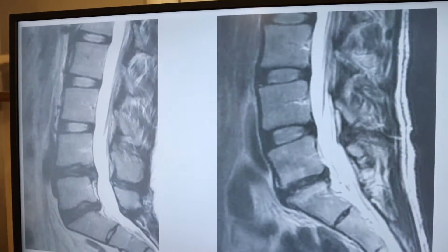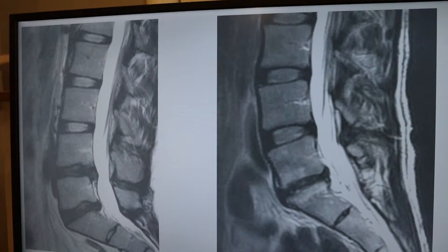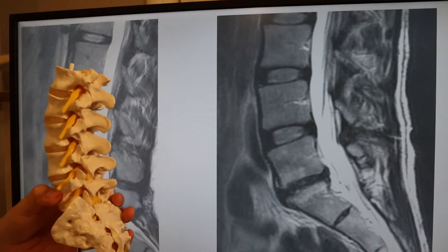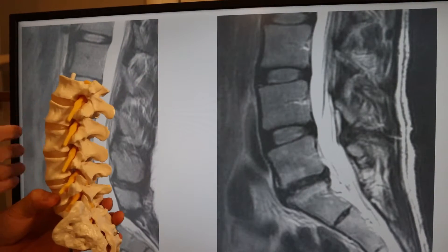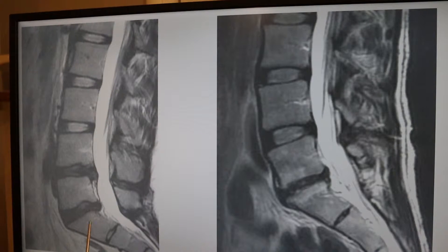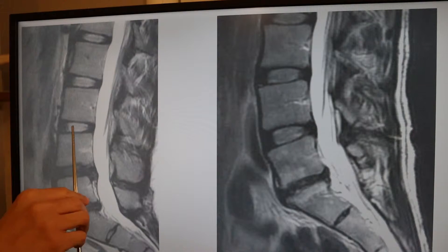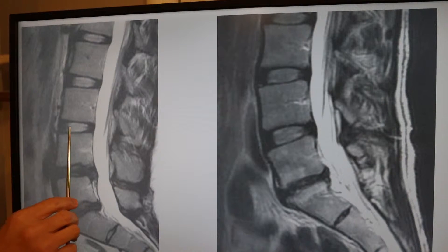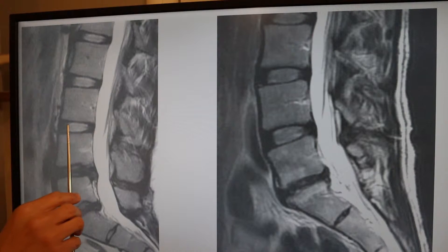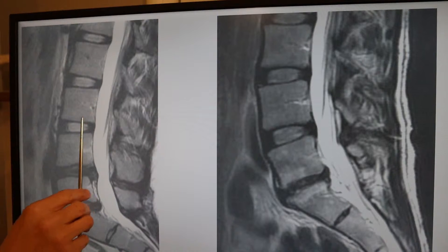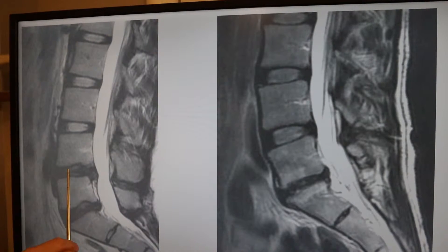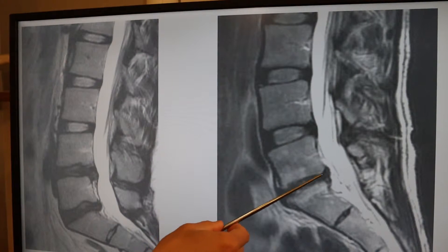Here's a good example of a patient who has the beginning onset of degenerative disc disease. This is a side view of the back — back, belly. The bottom bone is the sacrum. Moving up: L5, L4, L3, L2. The discs are named by the bones that sandwich them: L5-S1, L4-5, L3-4, L2-3. Here's a normal disc — the jelly inside shows up as bright, and the hard donut outside shows up as dark. At L4-5 and L5-S1, you can see the jelly has lost a little bit of height — this is the first stage of degenerative disc disease. As it progresses, the cushion gets flatter and flatter and the bones get closer together.